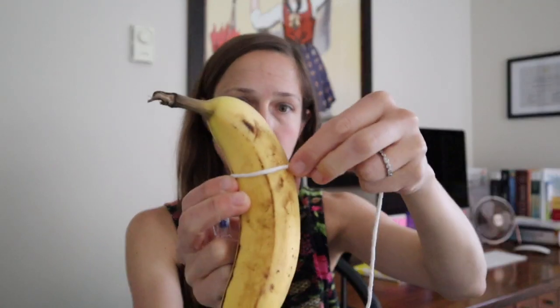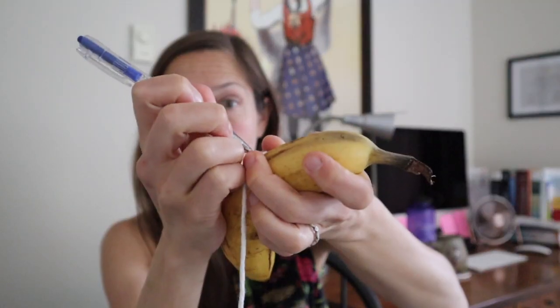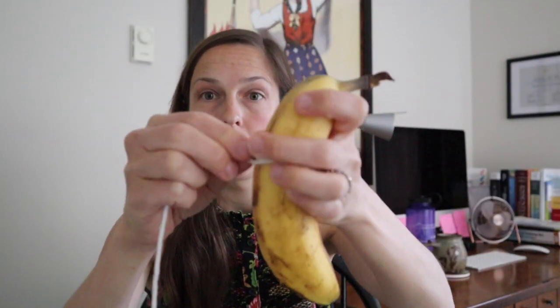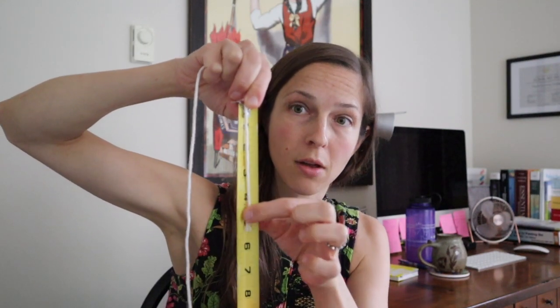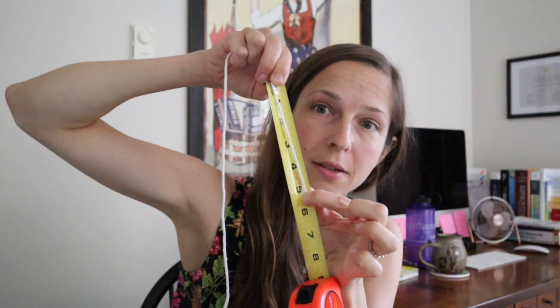Size of a condom is determined by your girth, or the thickness of your penis. There's going to be extra material at the bottom when you roll it down, so length is not as important as the girth. To measure the thickness, you have to do it when you're erect. Wrap the string around your erect penis and mark the length. Then take your ruler and measure the girth of your penis.